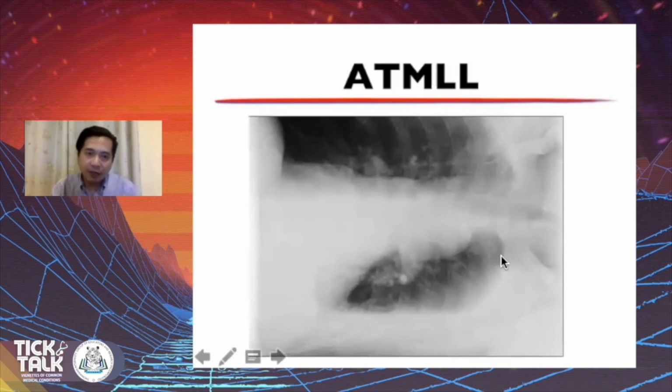Of course, in pleural effusion, we do the left lateral decubitus position to see if it's really fluid. If the fluid layered, or if it's more than 1 centimeter, it's most likely more than 500 ml of fluid. Here the fluid has layered, which means it's free flowing fluid. We call it layering.